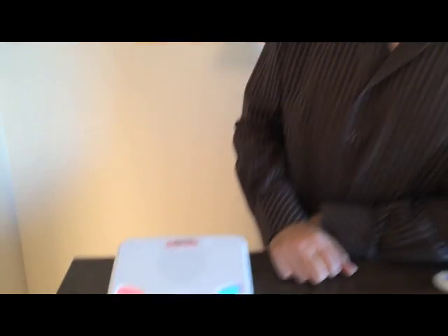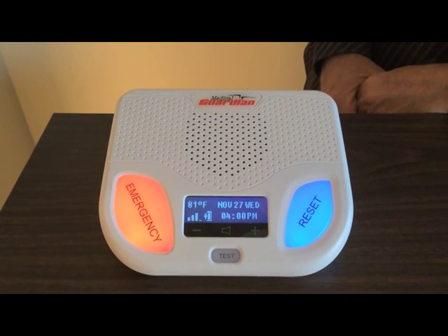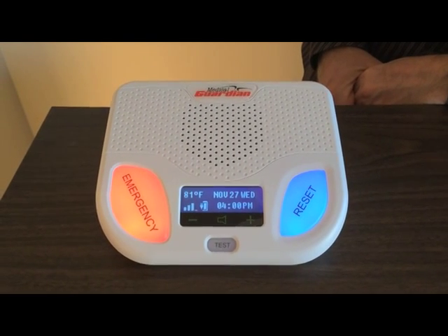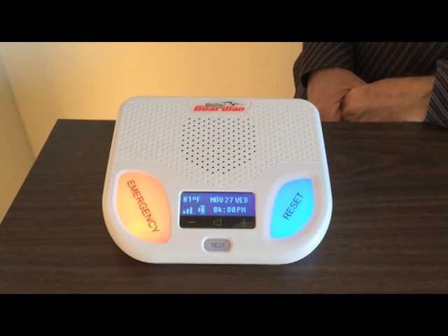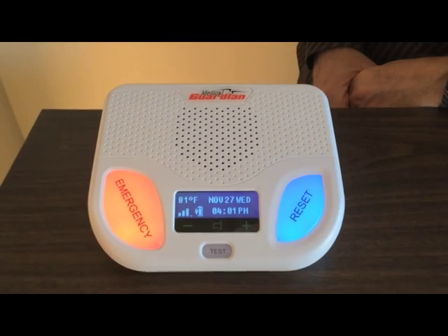Our test is complete. We press our alert button to see how the system works — call in progress, please stand by for operator. Thank you for testing your device, your test is now complete. Goodbye. So our test is done and the unit is ready to go.